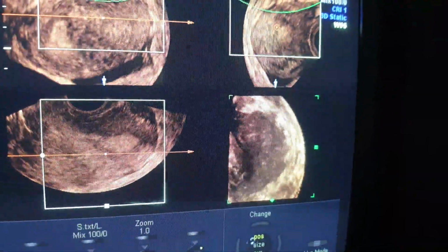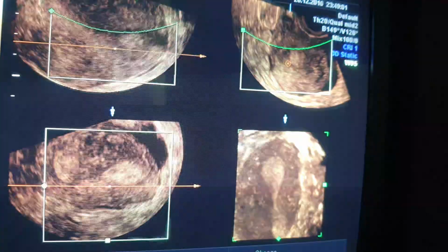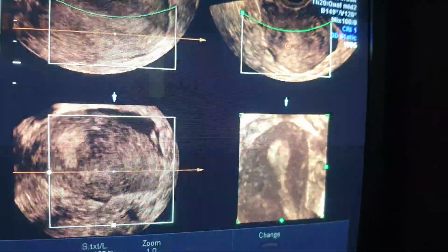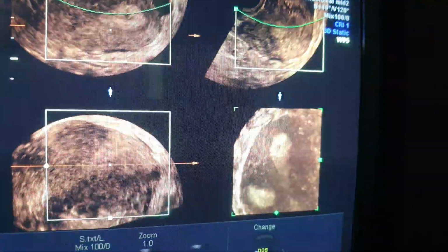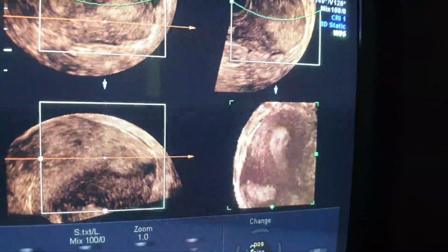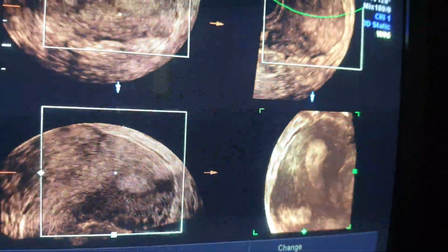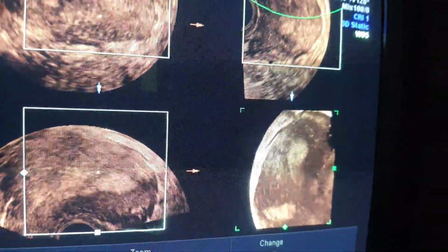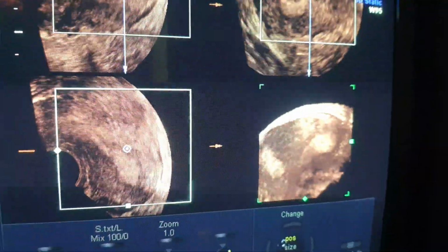You notice that in these rotations, while I'm rotating the picture, I completely change the acquisition, and suddenly you notice something appearing in this picture, okay? Here, when I'm working like this, you'll notice something appearing here.